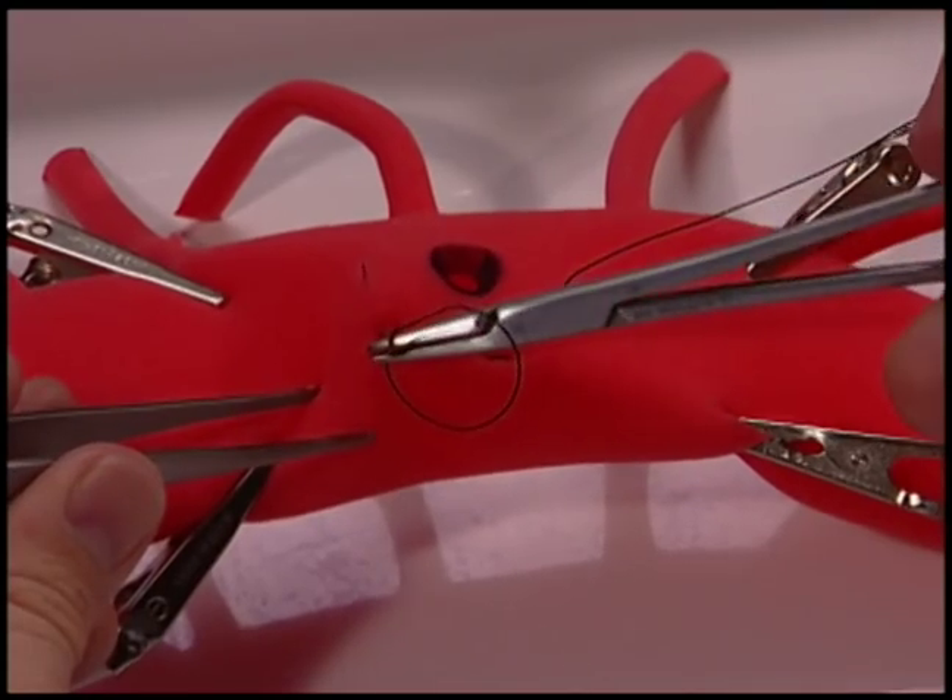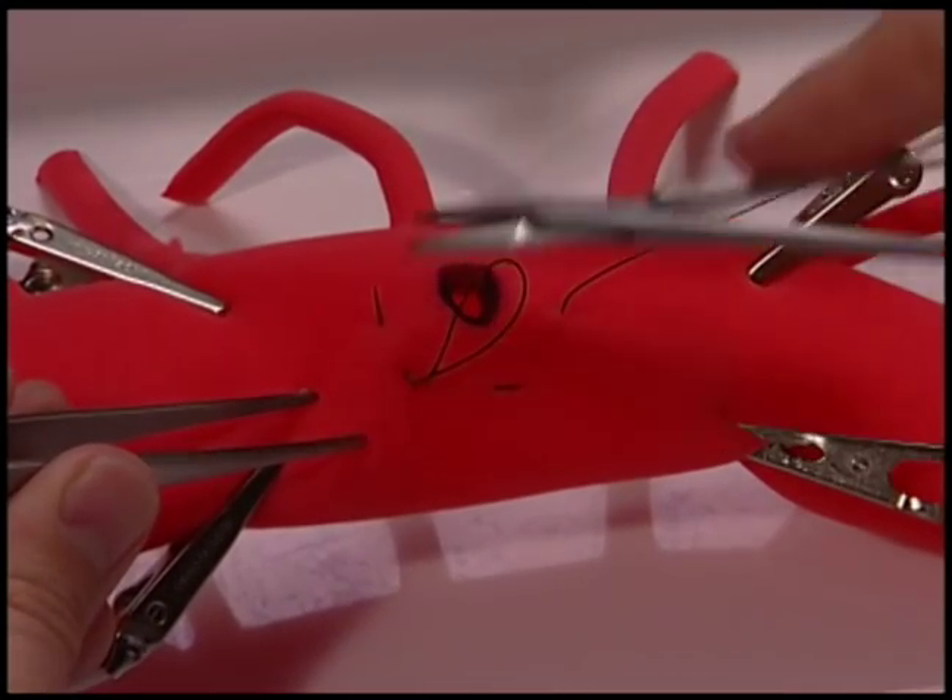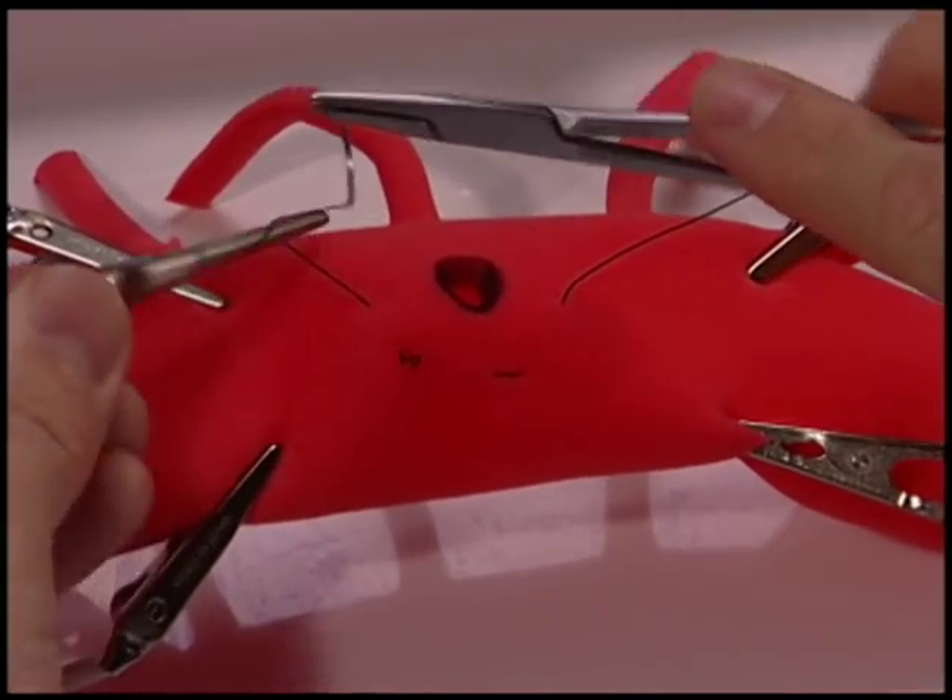By setting yourself up with the first stitch backhand, it avoids this awkwardness.